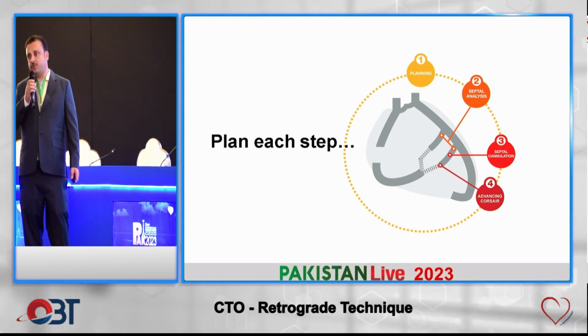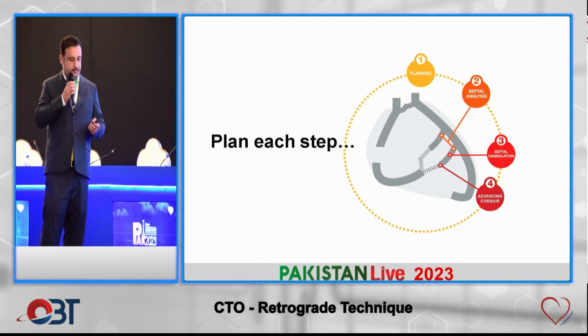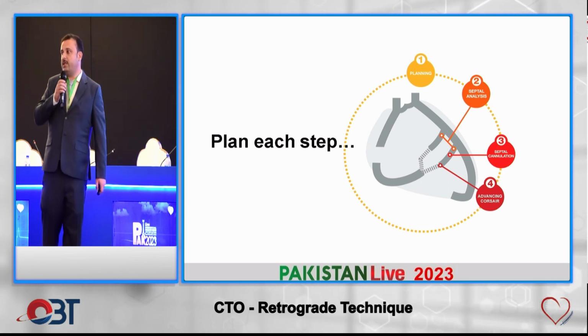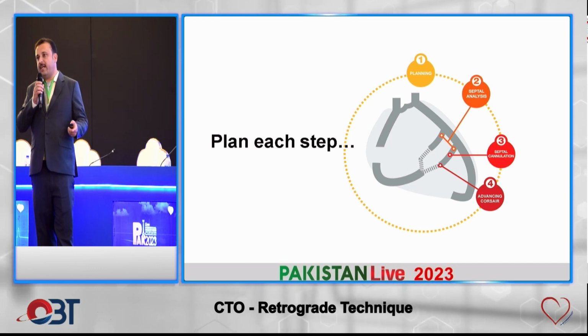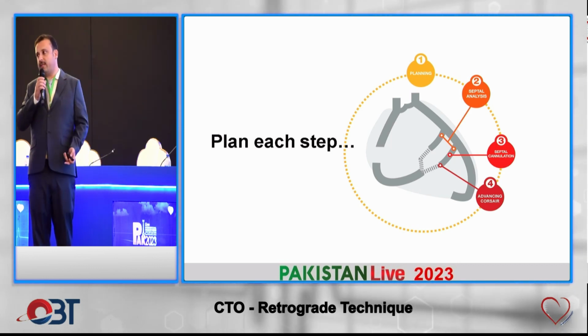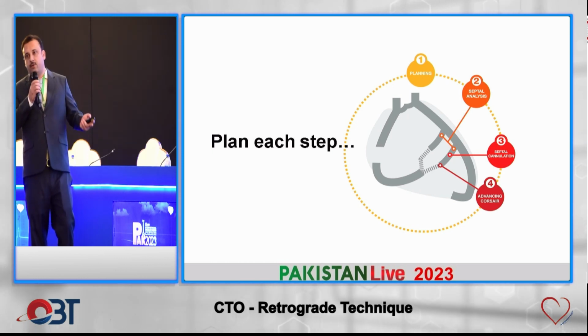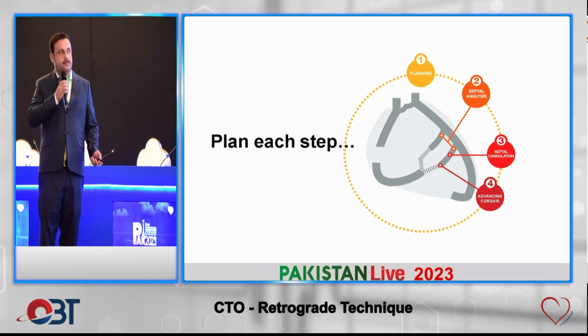For the right, it should be AL 0.75 or short AL, 7 or 8 French. The length should be 90 centimeter. This is important because if we take a longer guiding catheter, we can come across a problem of taking the microcatheter retrogradely into the antegrade guiding catheter, which we will discuss later in our cases.